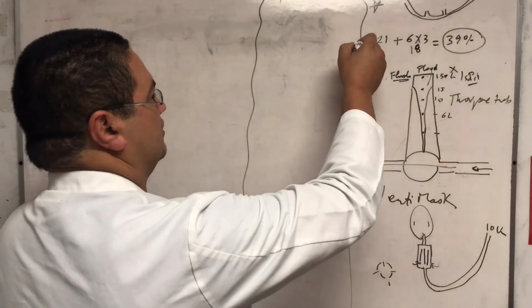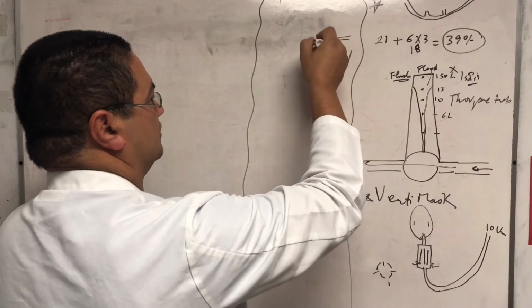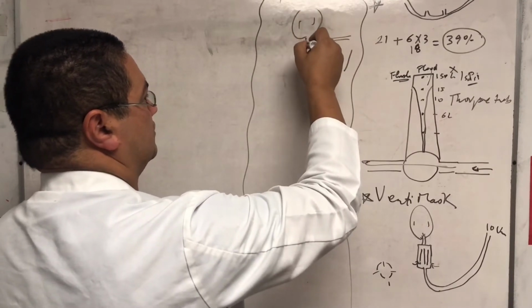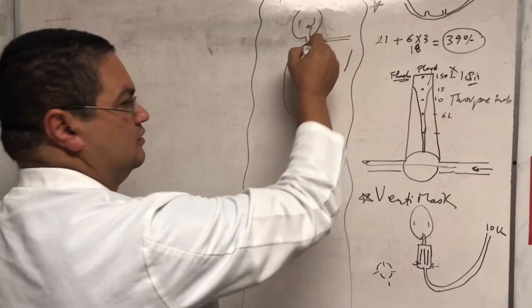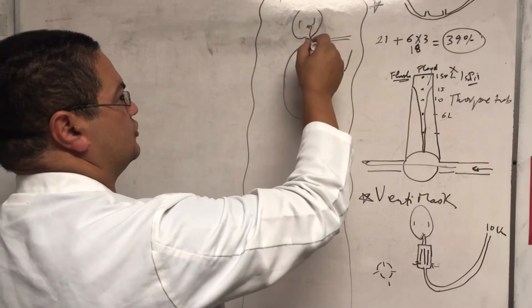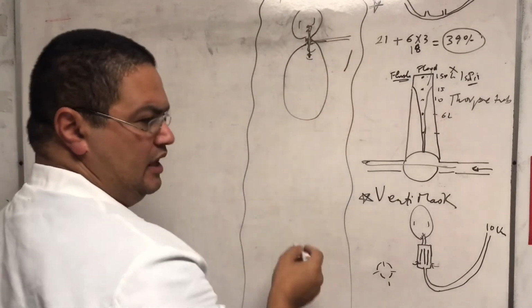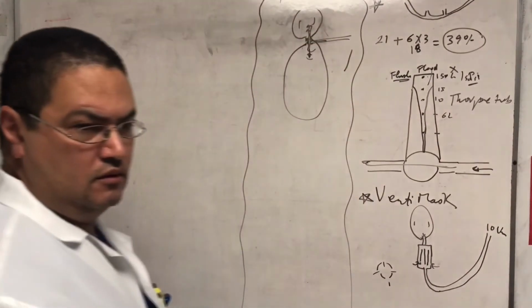But anyway, it goes like this. So basically, oxygen goes like this, goes to the mask, and goes also to a bag. So it goes here and goes here. And there's a one-way valve here that will allow the patient, if he wants to pull, it will come from the bag, but nothing of the exhalation can go into the bag, right?